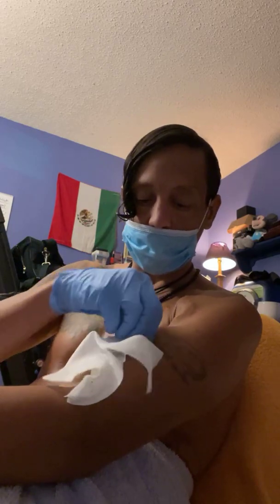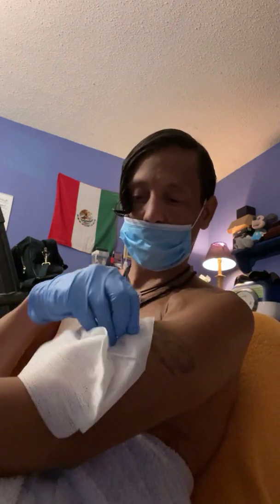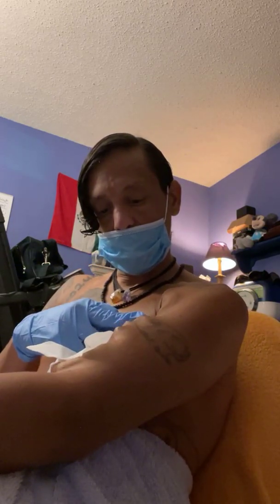So I use this gauze to just grab the little piece of skin that's left, so we don't get it in my body. Okay. That looks good. That looks clear. Now for the second one, the arterial. Nice. That one came off pretty smoothly.